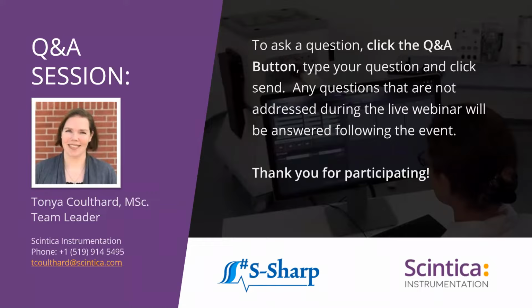If we think about heart rate, on a rat it might be anywhere from 200 to 300, maybe a little bit higher. On a mouse, it's going to be significantly higher. So the resolution of these two peaks has a lot more to do with the heart rate of the animal than the resolution of the probe. When the heart rate goes above 500 or 550 beats per minute on a mouse, those two things are happening almost simultaneously, and being able to resolve the E and the A peak becomes exceptionally difficult.